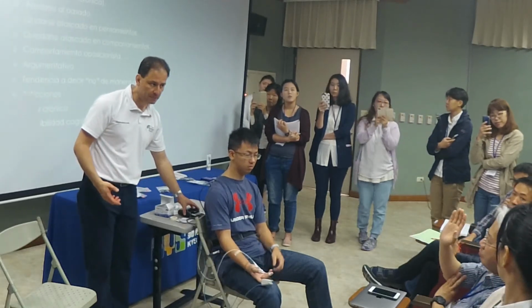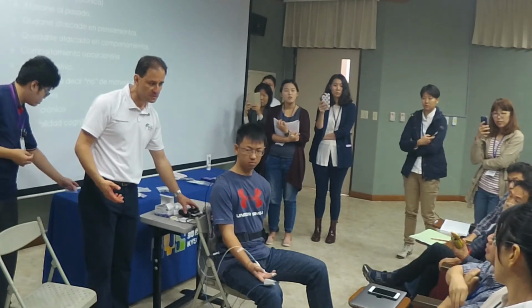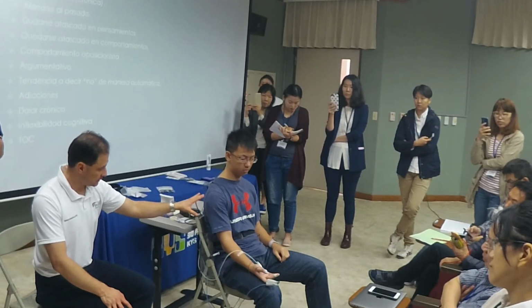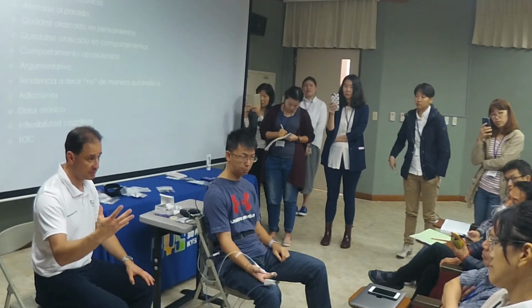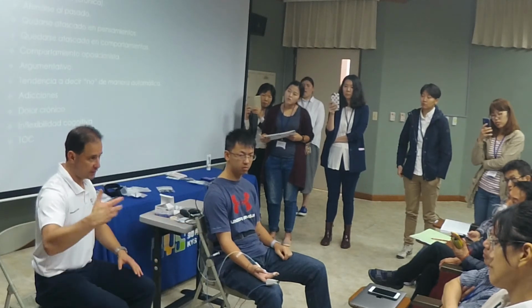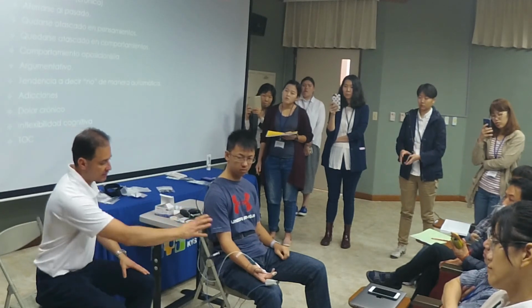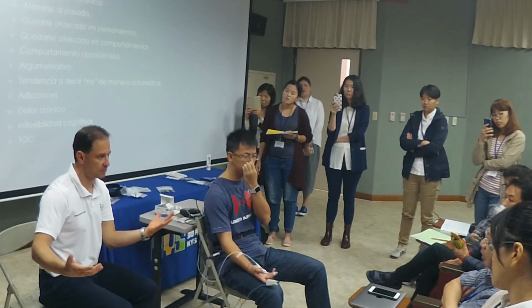Would you comment once more about the reason for placing all the sensors on the dominant side? Usually because there's more activity. As far as the heart rate goes, on the dominant hand side of the body the electromagnetic pulse of the heart is picked up better. As far as the temperature goes, there's more blood flow because the hand is used more. And then the GSR could be either hand, but I like the same hand just because I like to keep the uniformity to it, so I don't have too many cables moving.